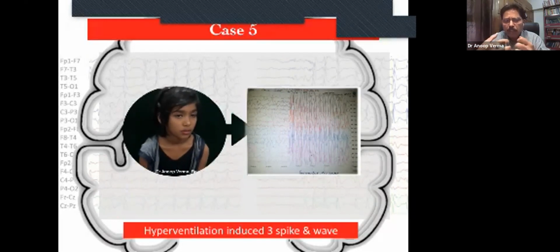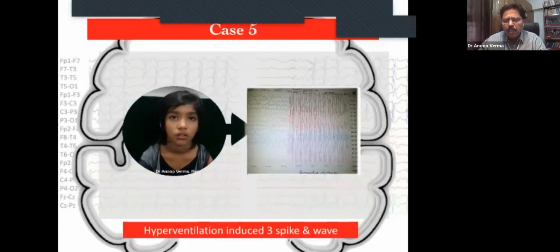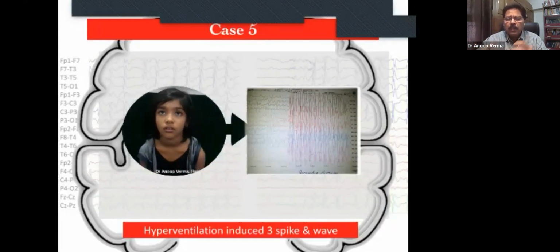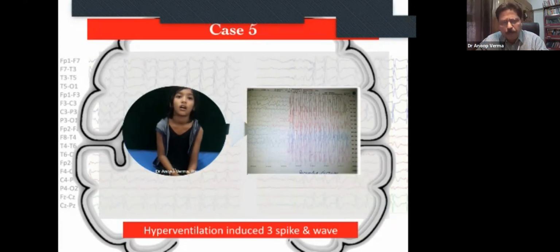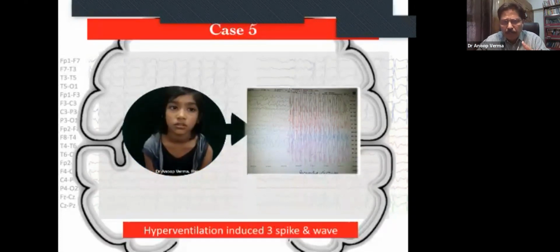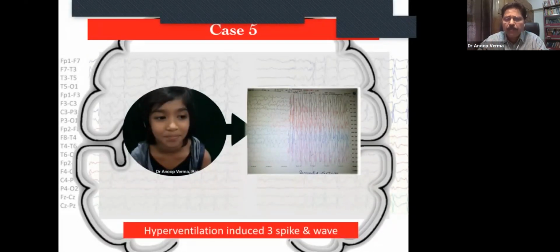the seizure activity, as in this child who is hyperventilated for 3 minutes, and in the EEG you are seeing the 3 Hz spike and wave. This is a very classical signature EEG of childhood absence epilepsy. And if a patient comes to you in your OPD and says he has frequent blank spells, ask the patient to do hyperventilation for 3 minutes. Your diagnosis will be confirmed in front of you in your OPD, and later on you can confirm by signature EEG. And this is very, very practical.